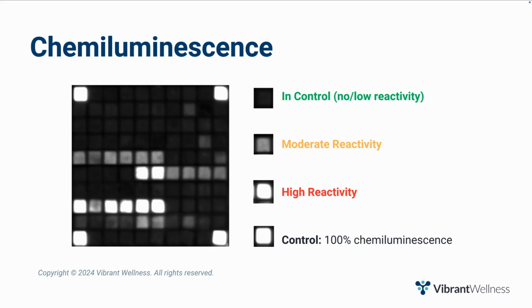Finally, a high-resolution imager is used to simultaneously detect chemiluminescent signals from labeled antigen-antibody reactions at each microchip throughout the multiplex microarray. Amplified chemiluminescent signals with high signal-to-noise ratio provide high sensitivity, meaning very few false negatives. This automated process allows for high-throughput, sensitive, and specific analysis of multiple biomarkers for minimal sample volumes.